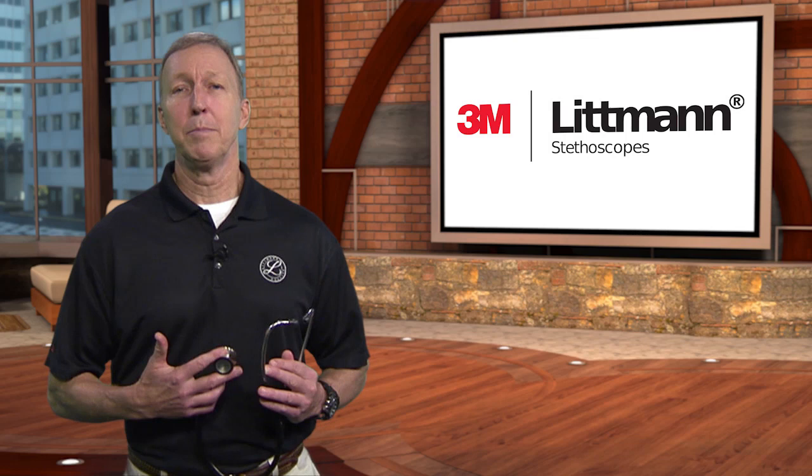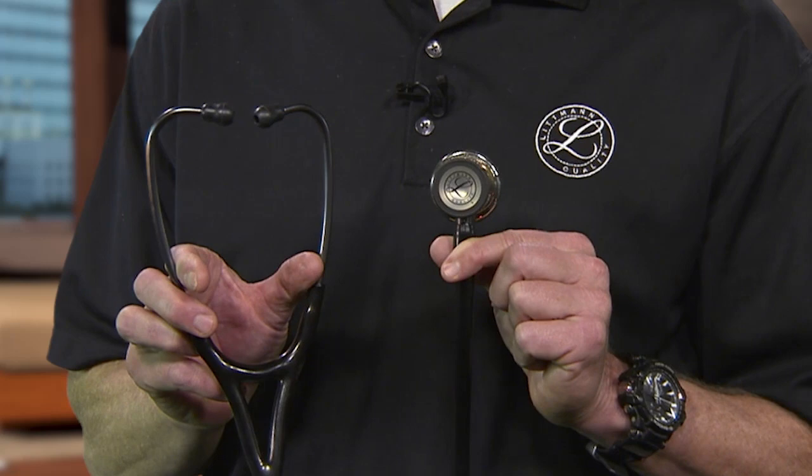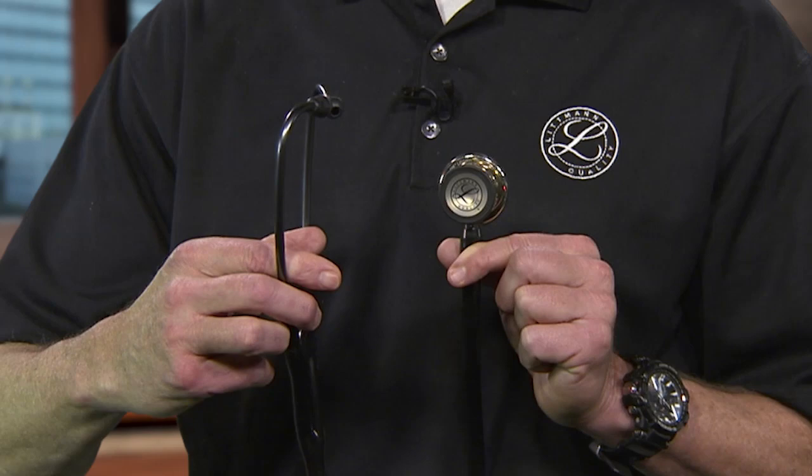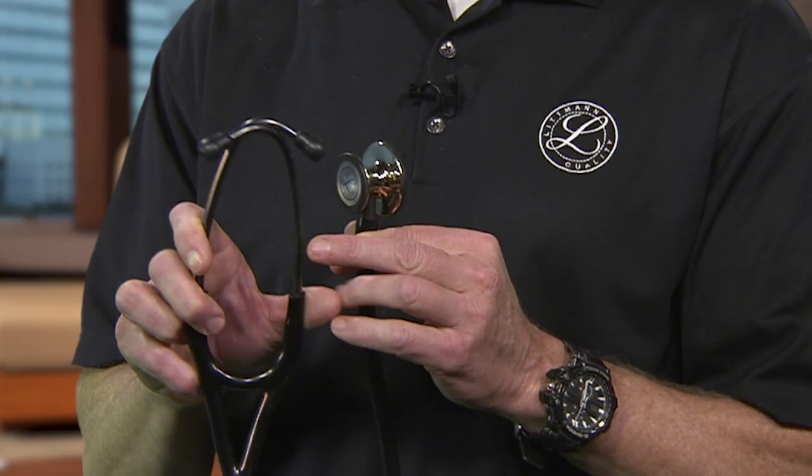Place your Littmann stethoscope over your heart and hear, see, and feel the following difference when compared to a competitor. Make sure the ear tips are pointing forward towards your nose, towards your patient, or facing forward when placing them into your ear canals. Most people's ear canals are facing forward, so we want the ear tips to be as well. Adjust the headset tension by squeezing or pulling apart the ear tubes to receive maximum sound transmission in a comfortable fit.